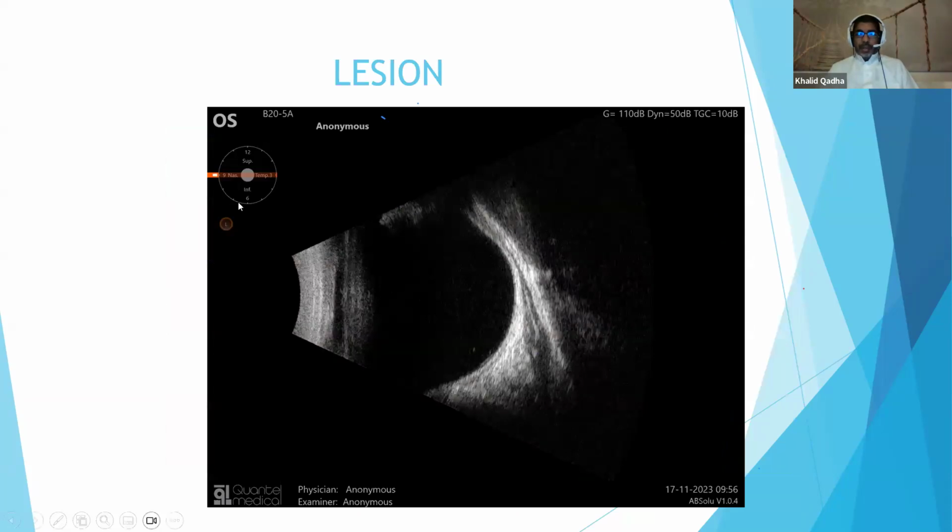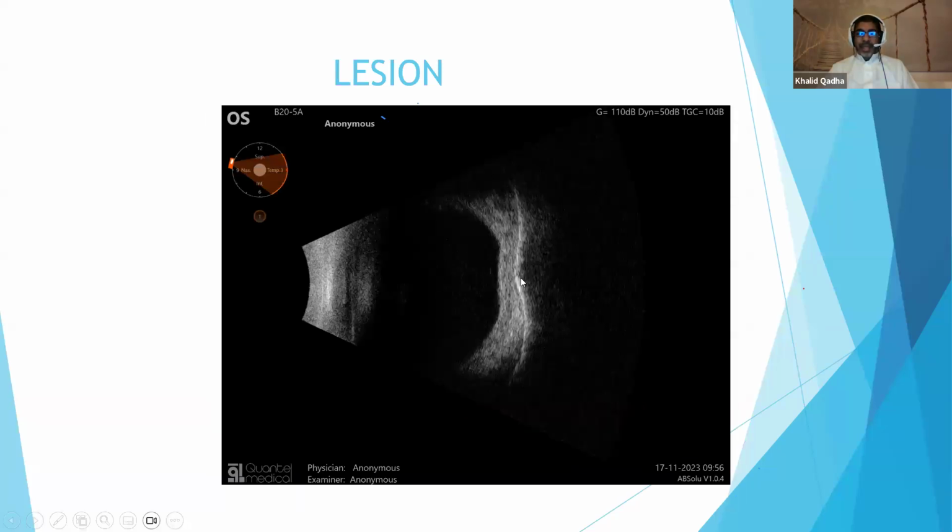This is one cut on the left eye, so that was the temporal side, and you can see the muscle, the lateral rectus muscle. But usually it's supposed to be thicker in this area, but it's too thin here, like it's been compressed. And when I did the transverse in the same area, you can see there is something pushing the globe, and thankfully there was no tumor.